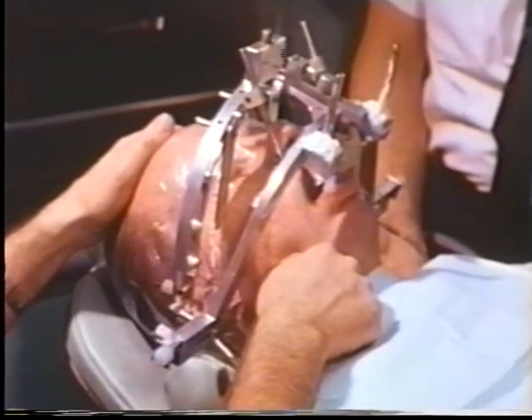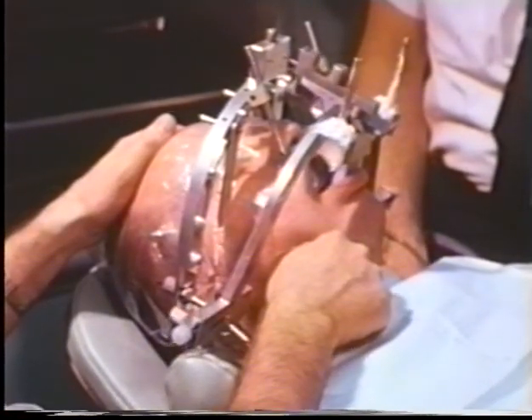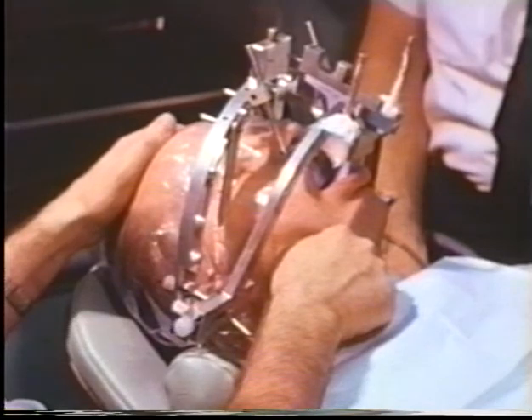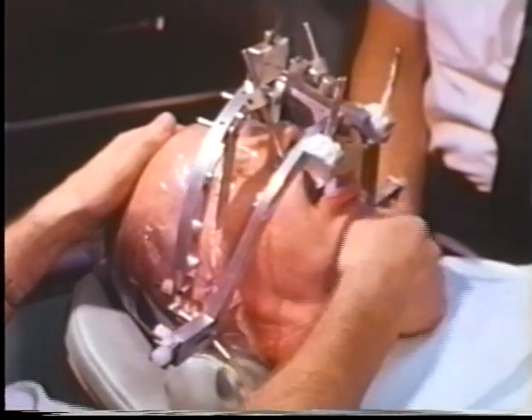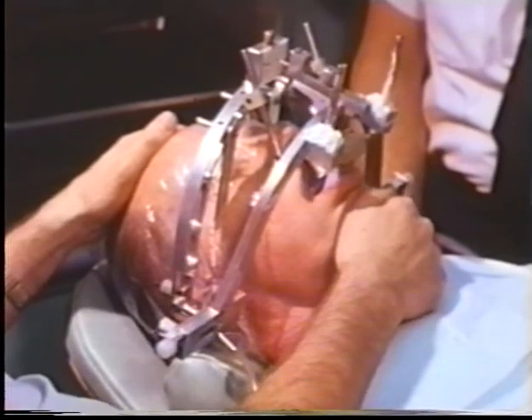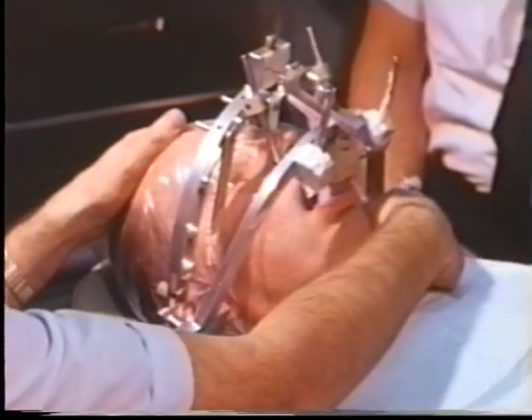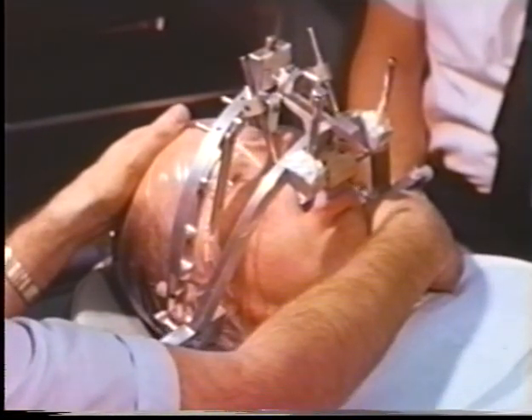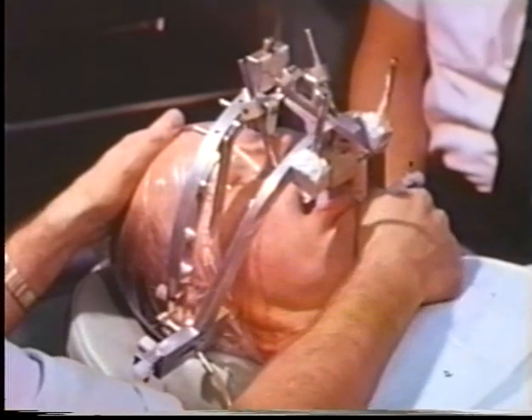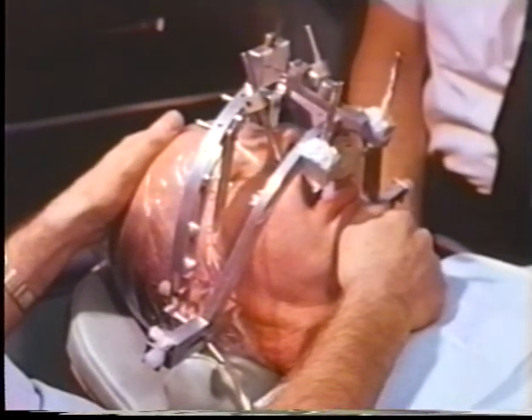The left lateral recording is verified by repeating the border movement to the left. And then to the right. These repeat movements are done to make sure that the mandible was tracing a true border movement. The protrusive recording is verified by repeating the movement.